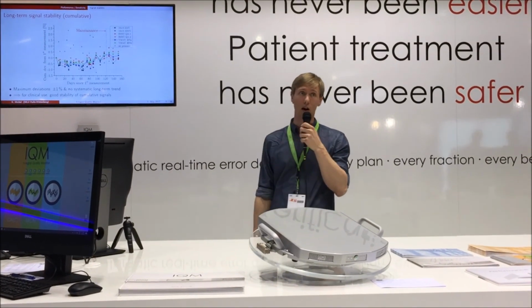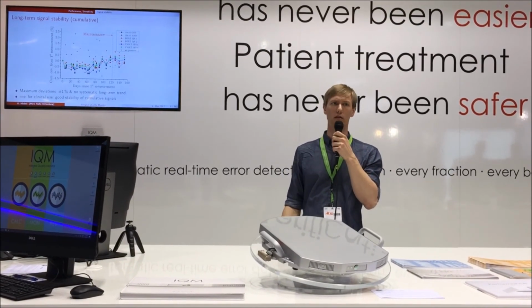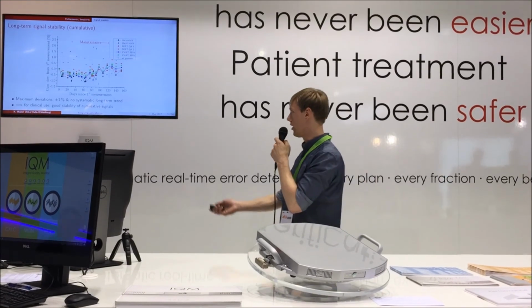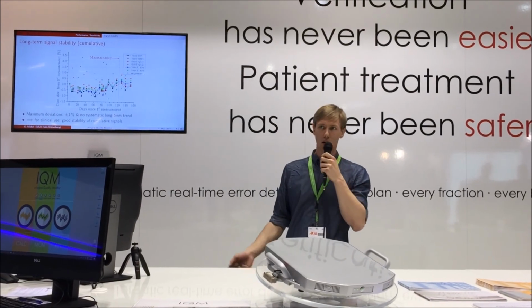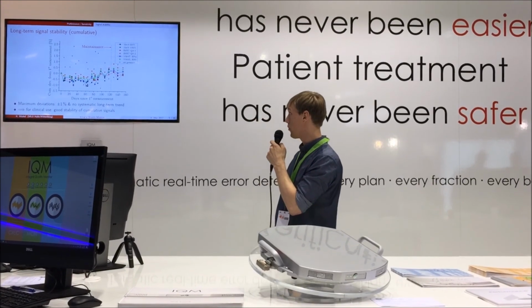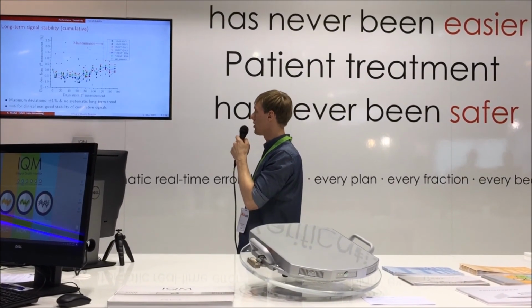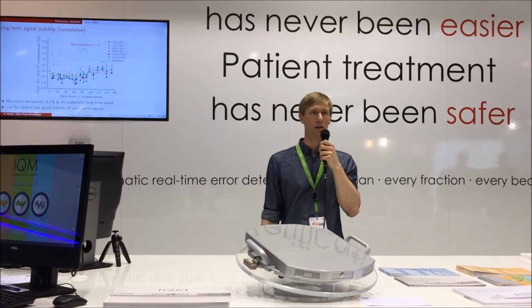So I measured the IQM signals of a varied mixture of IMRT as well as VMAT plans over the period of about 5 months, and I compared the cumulative signals of those plans with the very first measurement. Here in this graph we can see the cumulative deviations of the values obtained on a certain day compared to the same values measured at day 0. With the help of that graph we can observe maximum deviations of only plus minus 1%. We don't see any systematic long-term trends, and on top of that we only observe a really slight dependence of the IQM signal on the ambient air pressure.